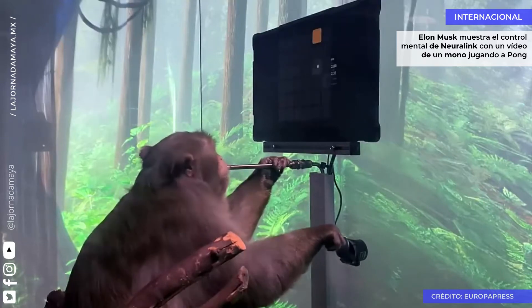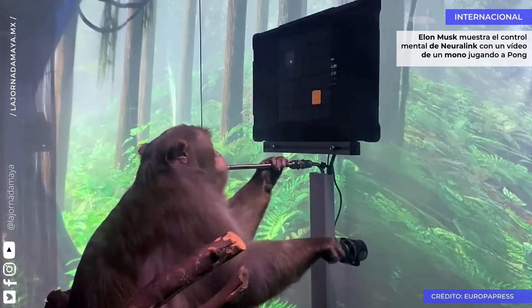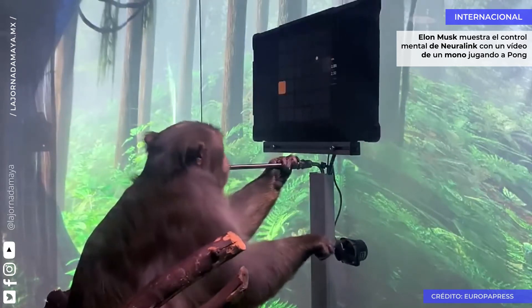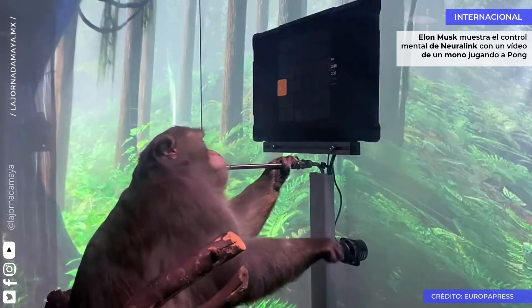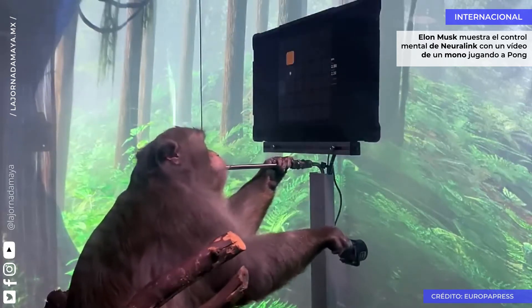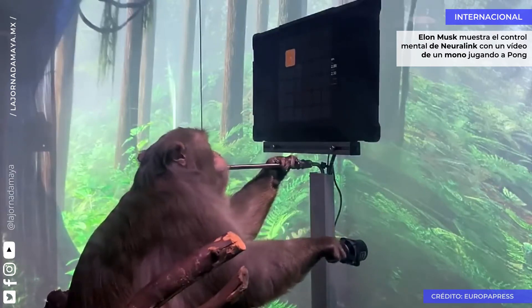By recording from many neurons and feeding their activity into a decoder algorithm, we are able to predict his intended hand movements in real time. First, we calibrate the decoder by recording neural activity as he uses the joystick to move a cursor to targets presented on the screen.